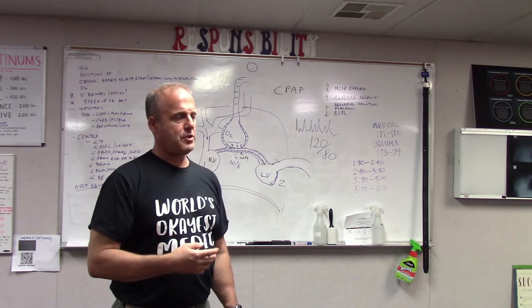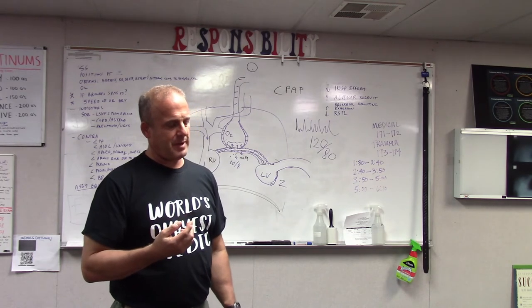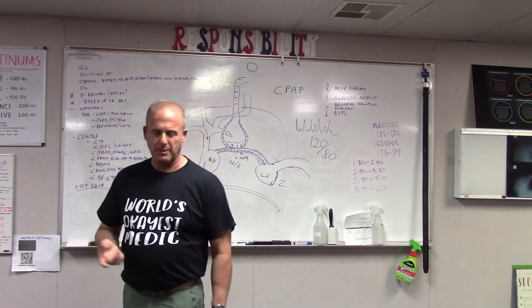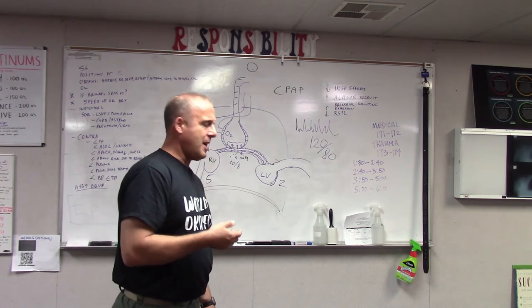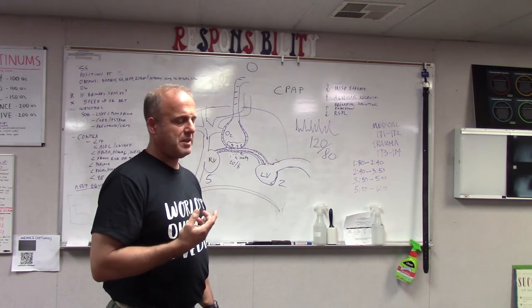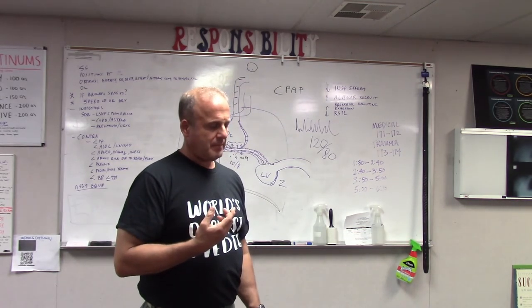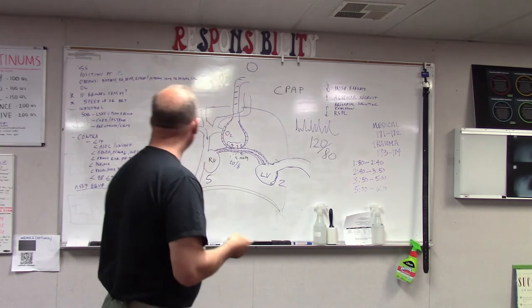However, we do give it for trouble breathing, and sometimes we don't exactly know what the trouble breathing is caused by. So hypothetically, it could be a pulmonary embolism, because you don't know, especially if it's been there for a while and you have some atelectasis building up. And hypothetically, it could be used for flail chest segments, although you probably still need a lot of pain control. Was there any other ones? Yeah, that's all I can think of right now.